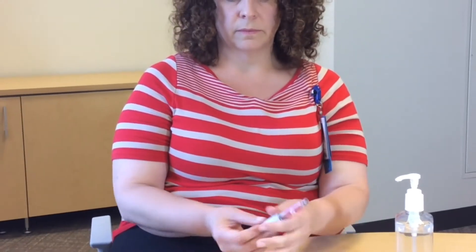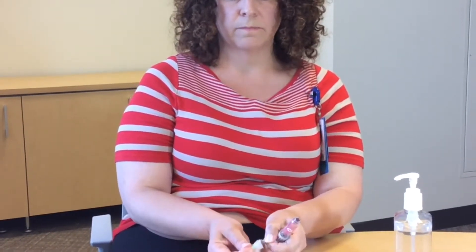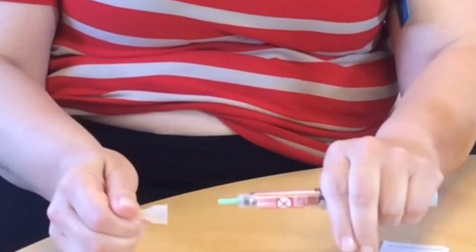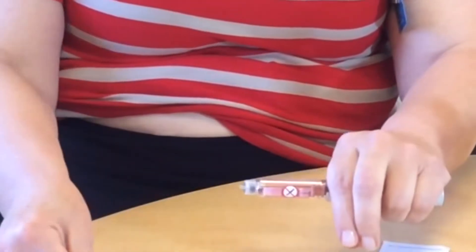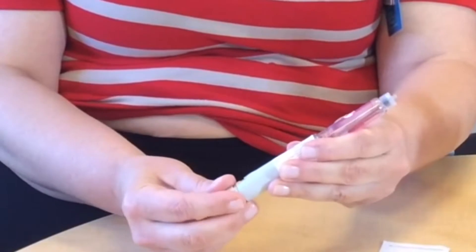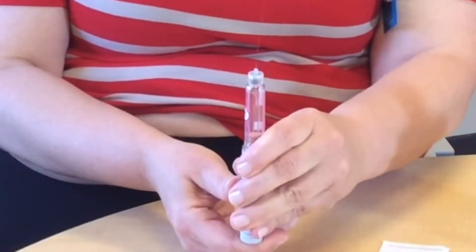Now we're going to prepare our pen. Place our pen needle, pull off our caps, and then prime just for good measure.